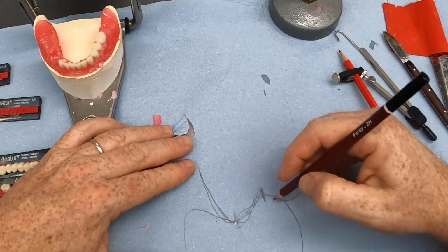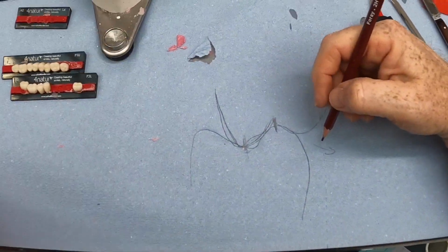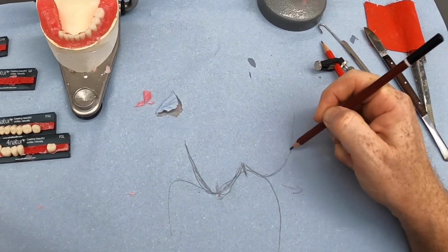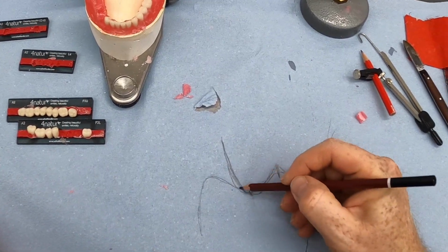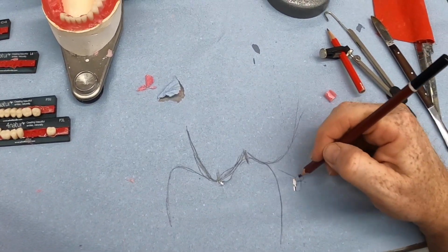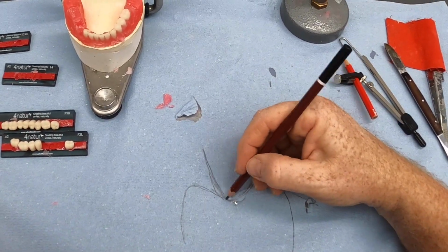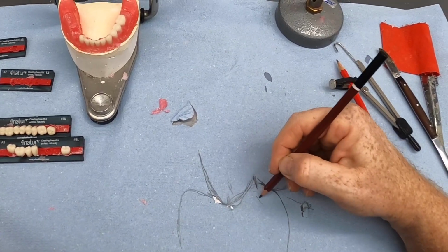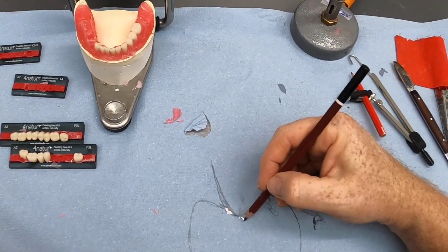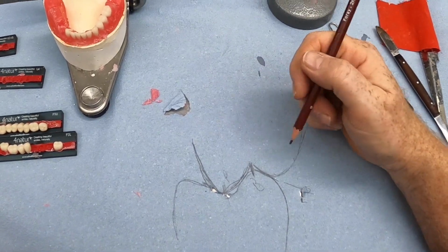Not always the easiest thing to do, because when we go into the lateral excursion, it means that, hope you can see this, colour it in a bit. There's the upper tooth, there's the lingual cusp of the lower, buccal cusp of the lower. When we go into the lateral excursion down in this direction, it means we've got to get these contacts sliding nicely, and this contact sliding nicely. So this palatal cusp and the buccal cusp, the functional cusps, have to slide down harmoniously with the movement of the mandible, which is of course dictated by the condyle.